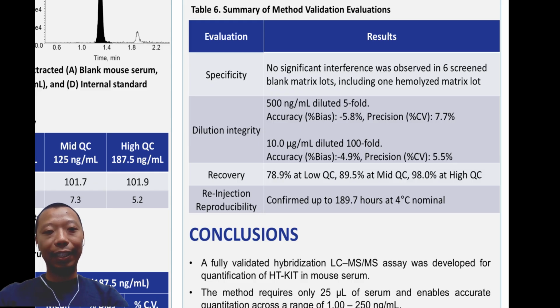Recovery was consistent across QC levels, indicating reliable extraction efficiency throughout the assay. Reinjection reproducibility was also confirmed for up to 189.7 hours at 4 degrees, supporting reliable sample reanalysis.